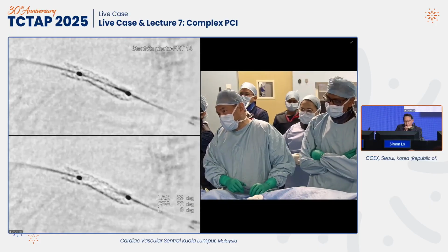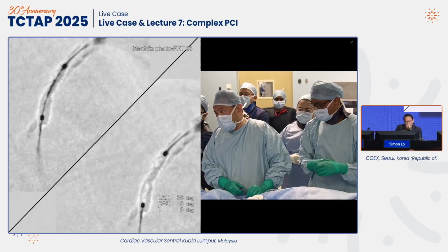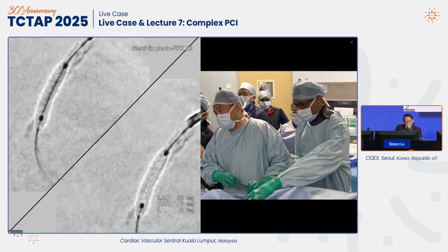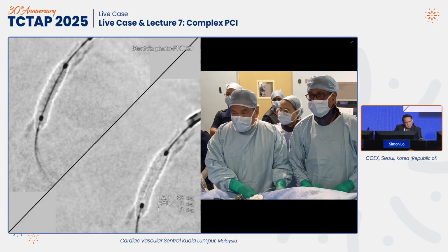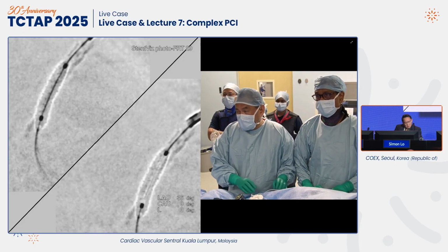In the bench testing, of course, they do not want to reveal exactly how it is attached, but in the bench testing, it's never happened. And we have used 20 in a very, very difficult case. You used it on an extremely difficult case, and we have not seen a single one come out. So we're fairly confident now.